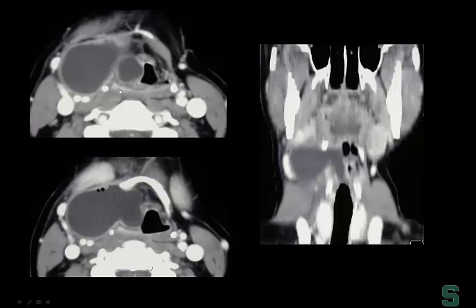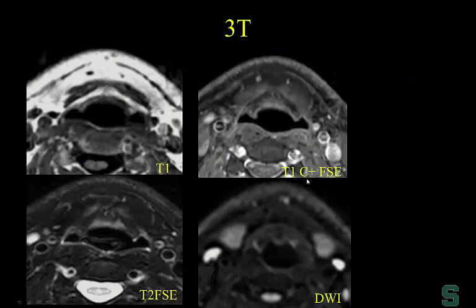Here's an example — a cystic lesion involving the larynx, extending out through the thyrohyoid membrane, very nicely seen on the coronal images, and extending out into the soft tissues of the neck. This is a laryngocele. We'll have more to say about that.